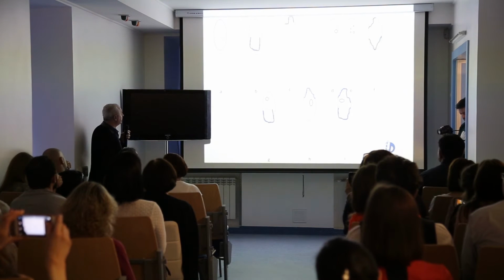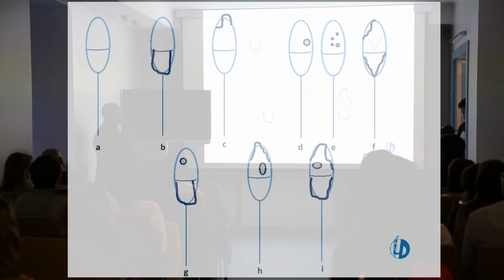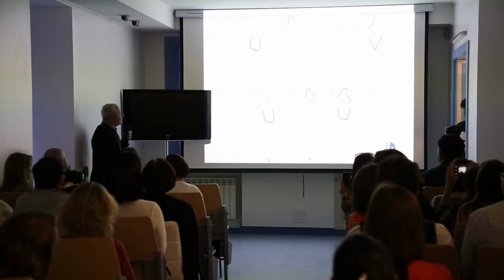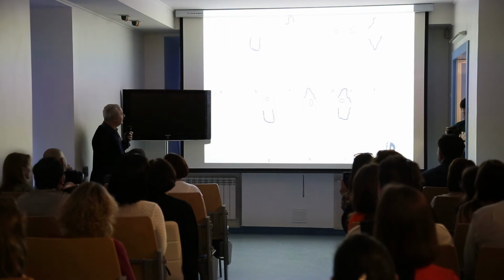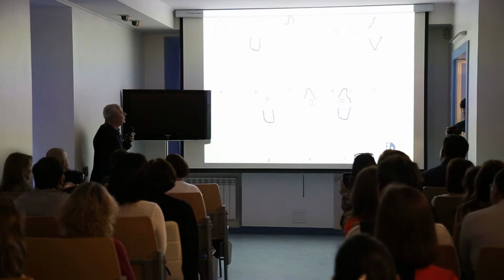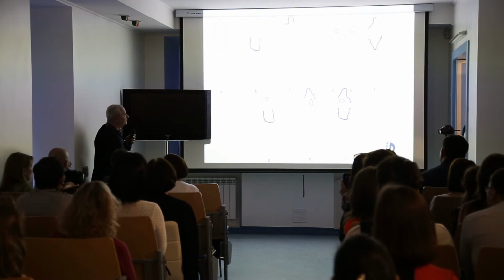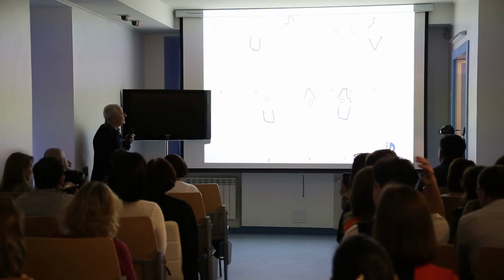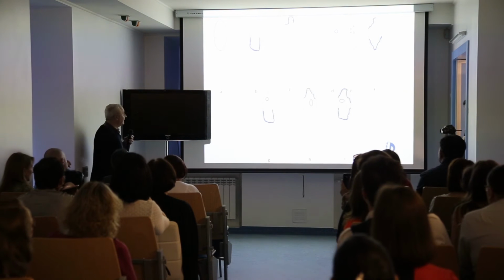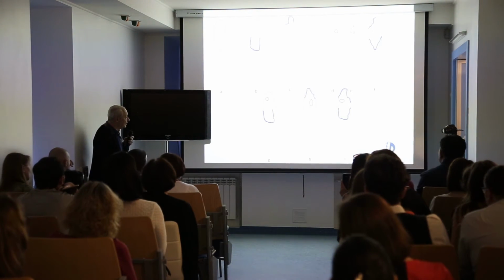This is normal, 6 points. This is 5, because there is abnormality just on the basis. And here there is a morphology of the head. This is 2 points less, so it makes 4. And if you have an association with the vacuole and the basis, it makes 2 points because you decrease. And the worst is this one, because you have a vacuole and the morphology.